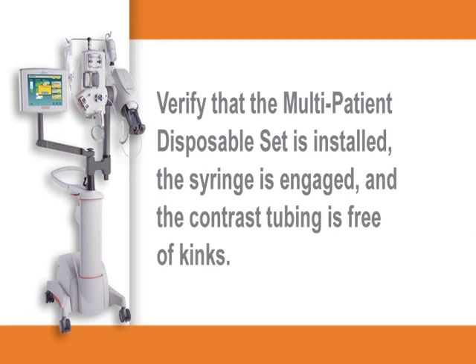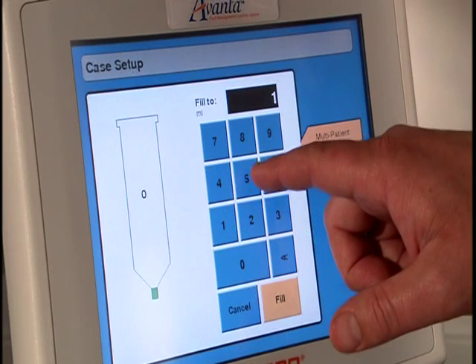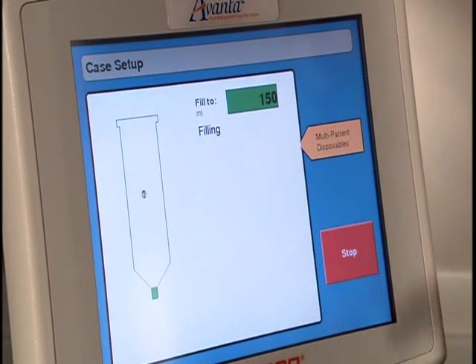Before proceeding with Step 4, verify that the multi-patient disposable set is installed, the syringe is engaged, and the contrast tubing is free of kinks. If so, touch Fill Syringe. Enter the desired amount of contrast, then touch Fill. A graphic representation of the syringe filling is displayed along with the volume.